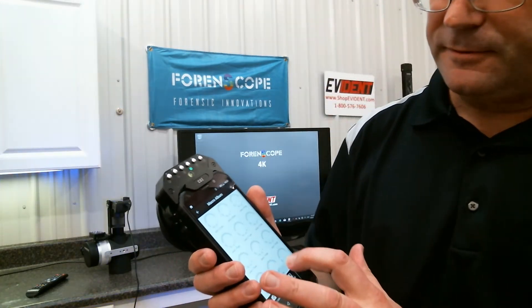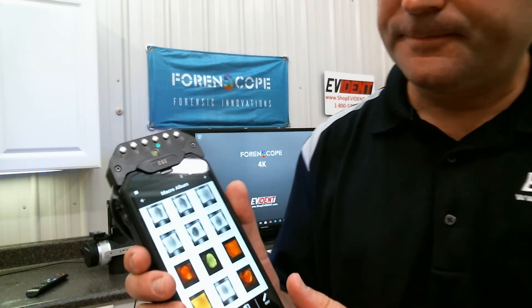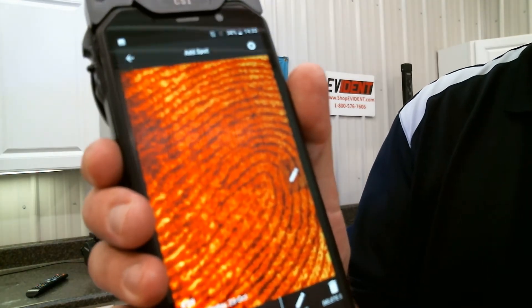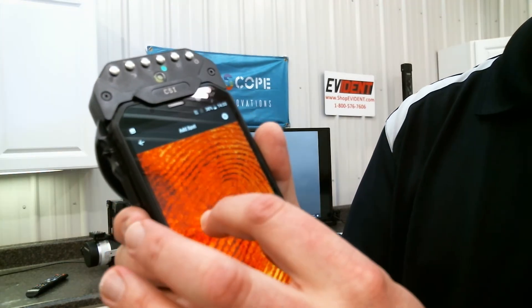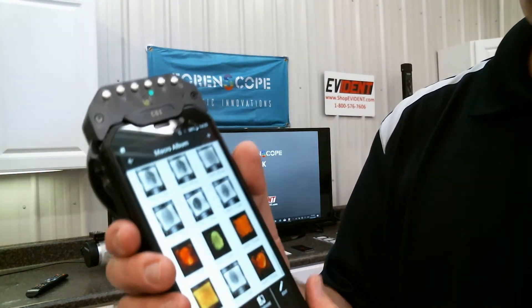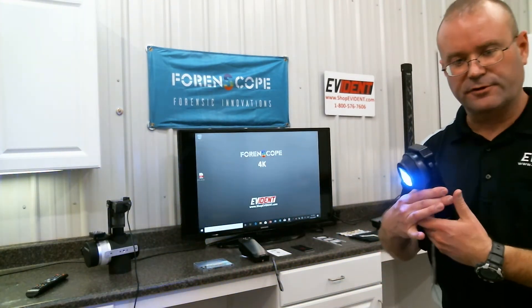Let's see what we've got here. Look at all the detail. Wow. Super easy to use. Super clear. Lots of detail. So it has the capability on treated fingerprints and fluorescent fingerprints.